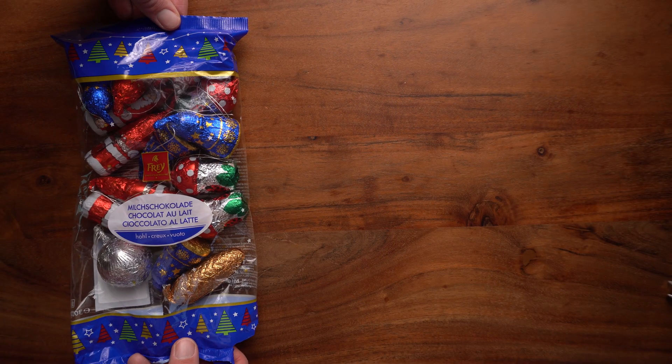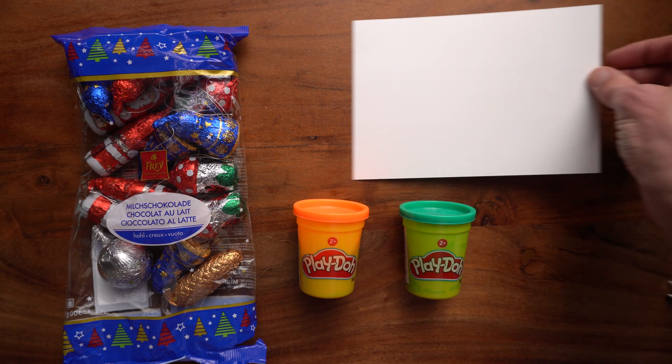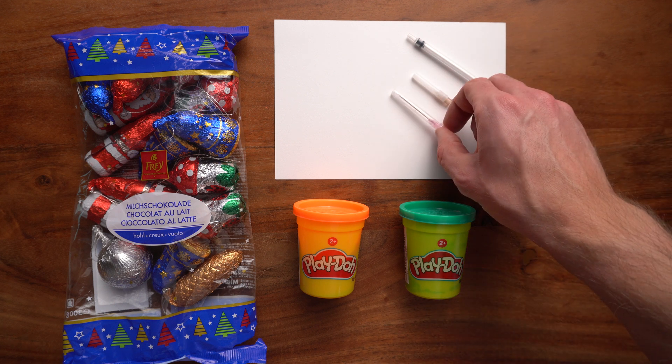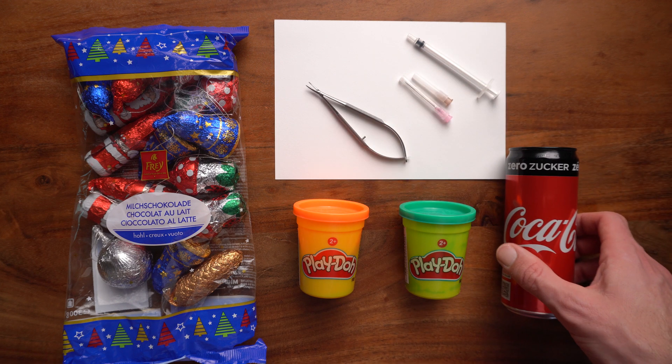You're going to need the following things: a bag of Christmas chocolates, Play-Doh preferably in two colors, a piece of paper, a one milliliter syringe, a 27 gauge needle and an 18 gauge needle, a needle holder or forceps, and an empty soda can.